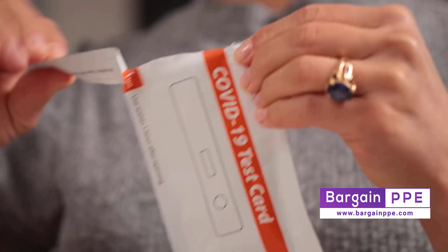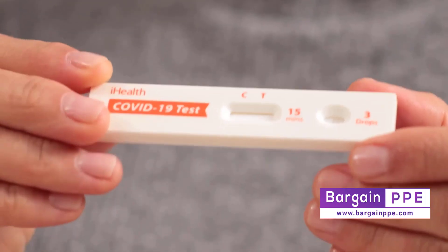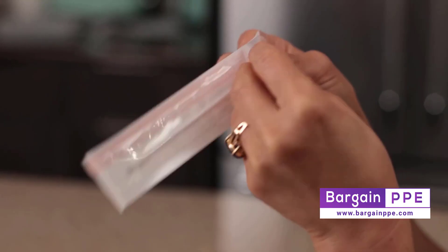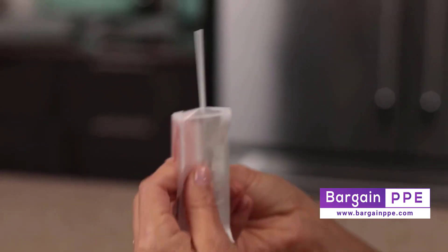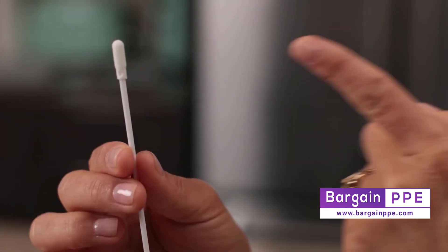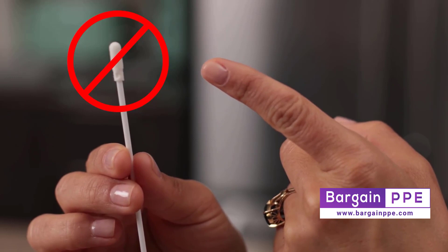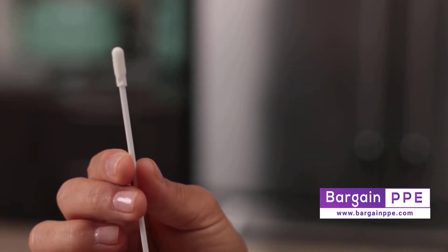Tear the foil packaging off your test card and lay the card upright so that it's ready to receive your test solution once you've taken a sample. Open the handle end of the swab package and pull out the swab. Be sure not to touch the swab end with your fingers or bring the swab into contact with any potentially germy surfaces other than the inside of your nostrils, of course.